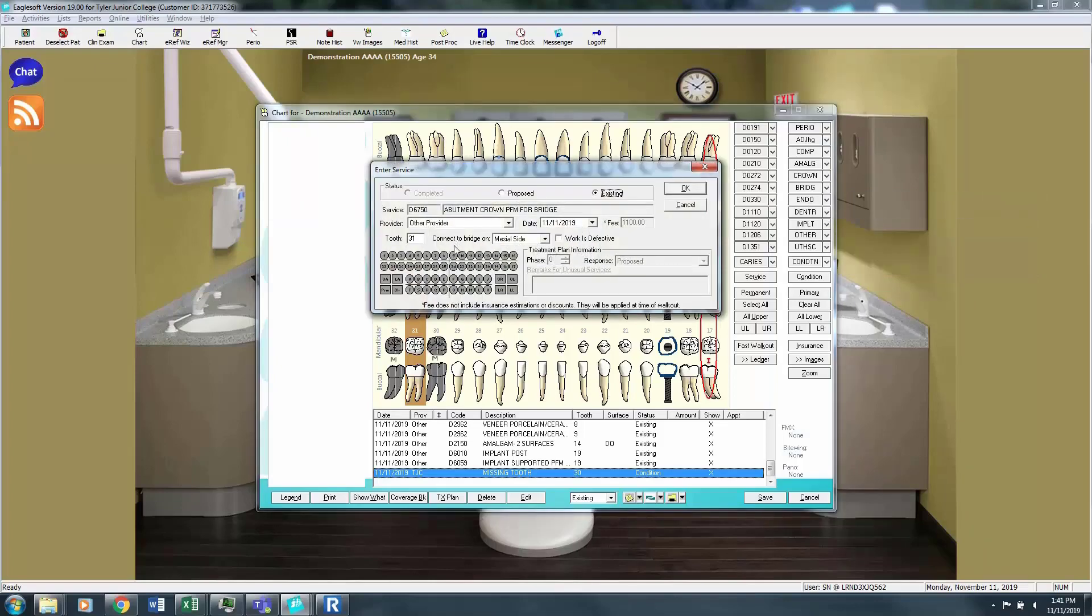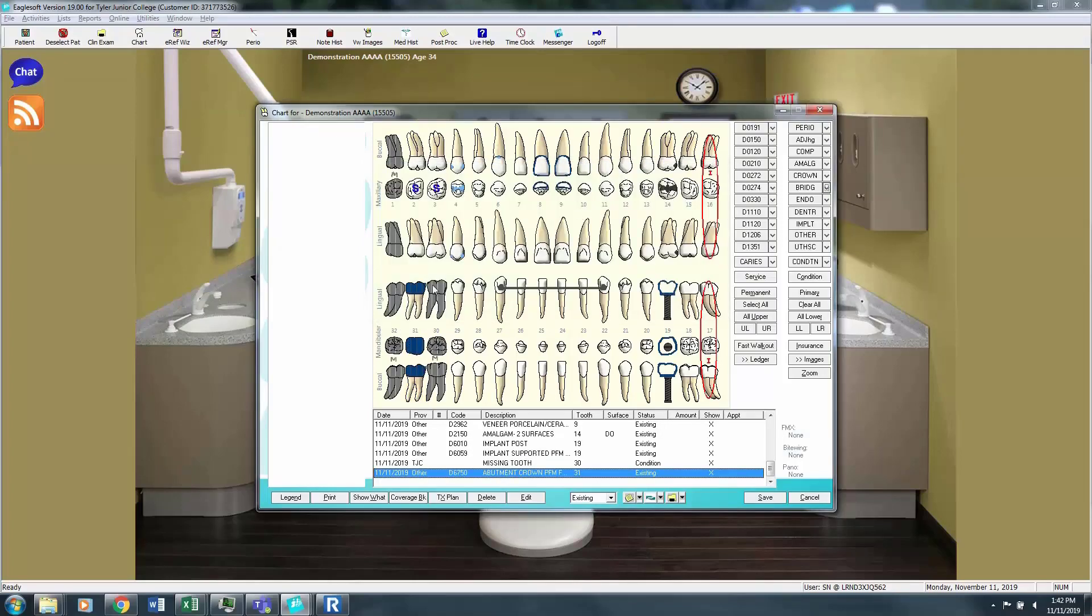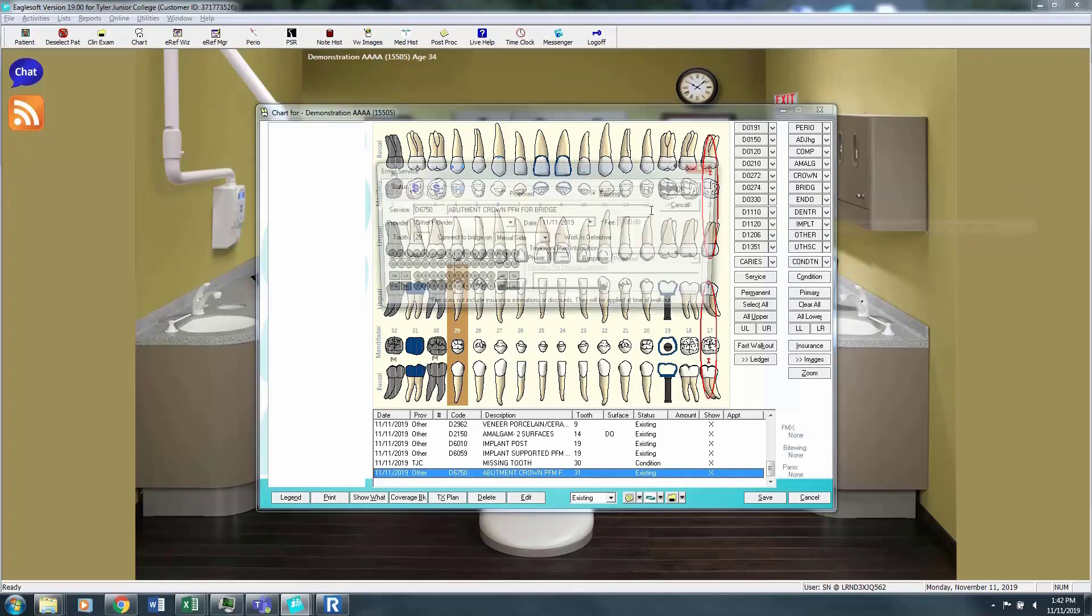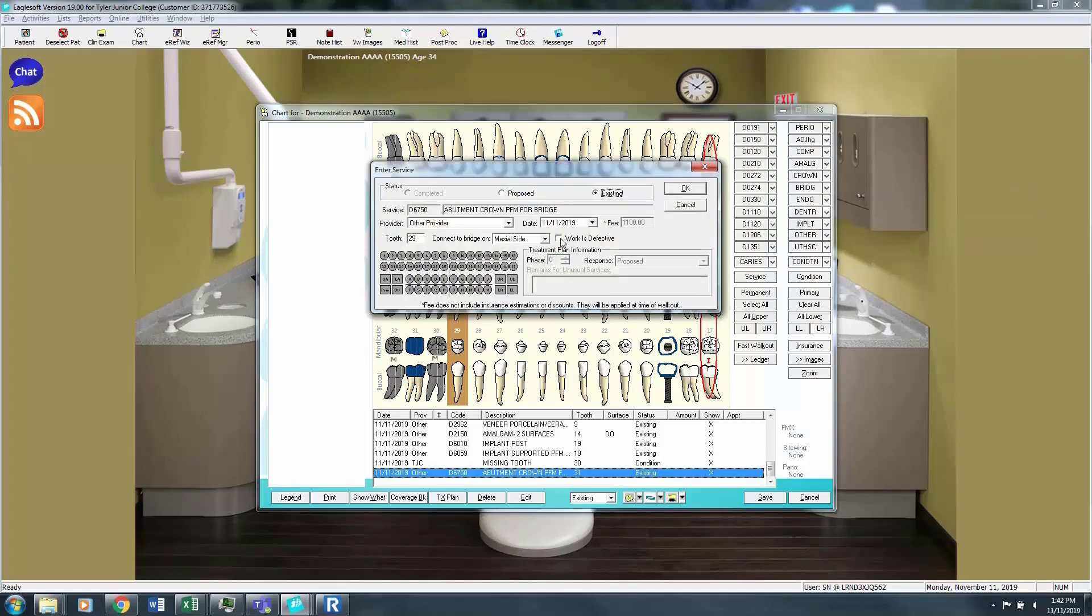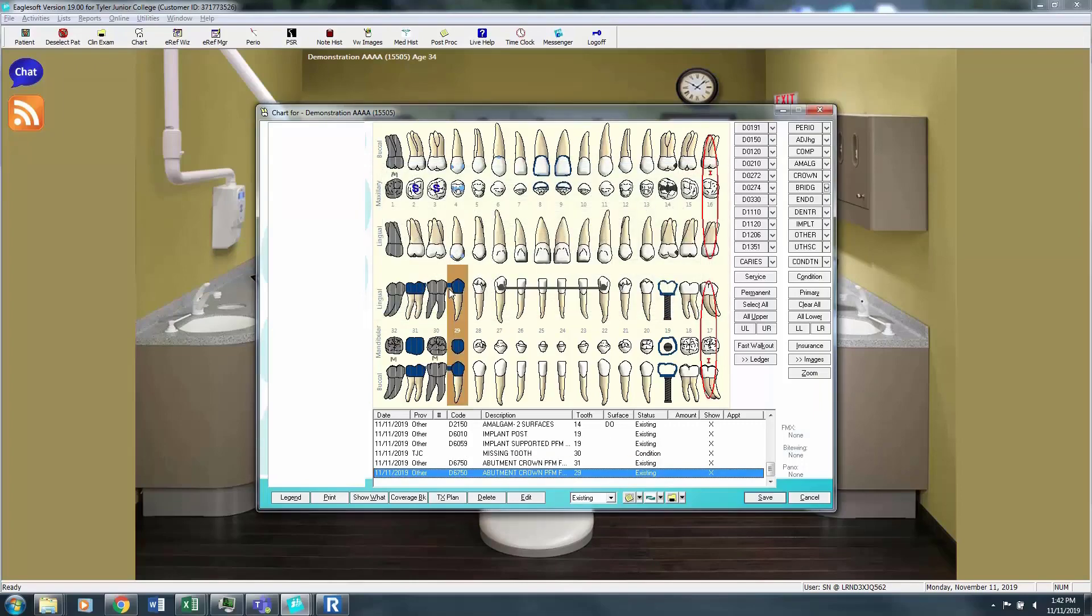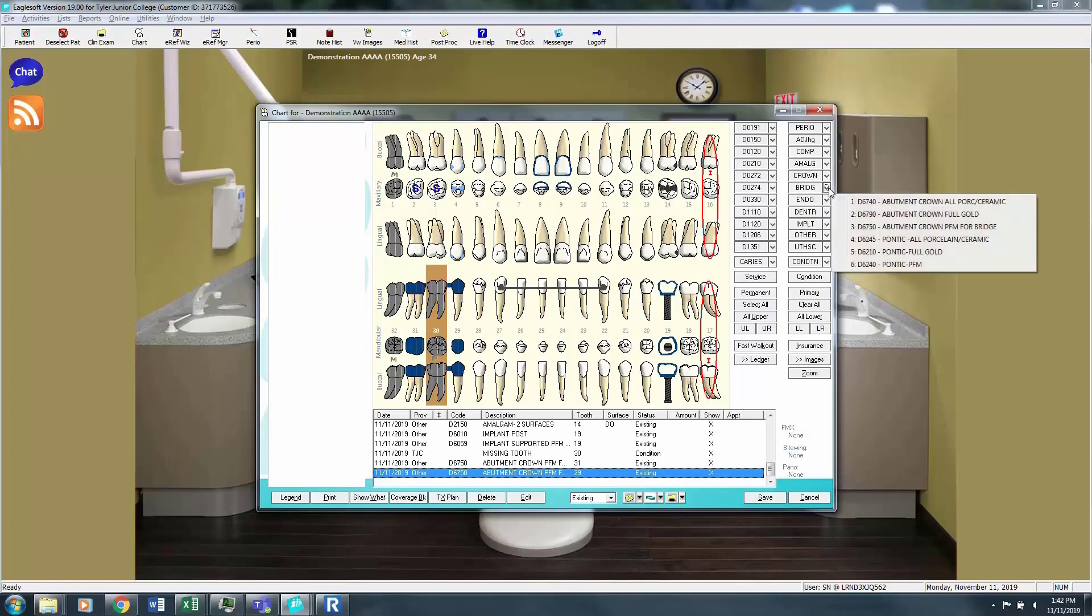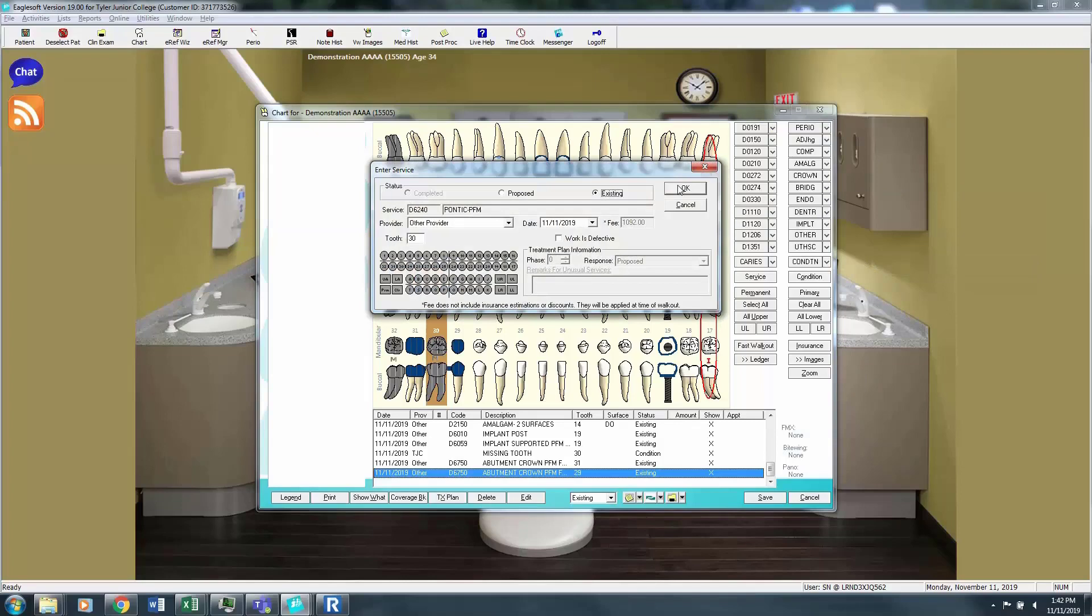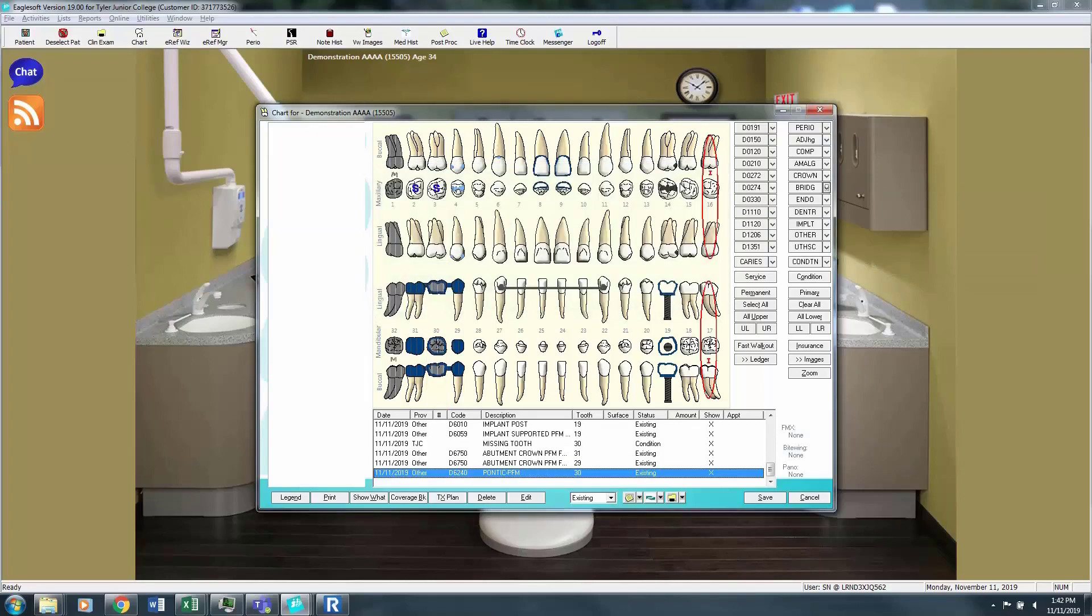Now when you're doing an abutment, you need to make sure you connect the bridge to the correct side. So I'm going to connect the bridge to the mesial side for this tooth. For 29, I'm going to be doing the distal side. We have a drop down menu. Distal, existing. Now I'm going to make my missing tooth a pontic. And you can see there it took my roots away. So this would be a bridge.